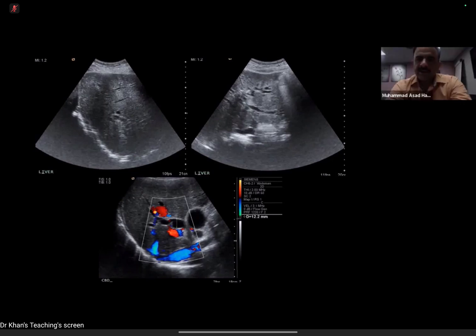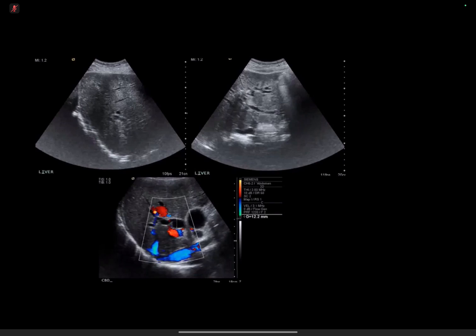Brilliant. Well done. How do you do that? So that is done under local anesthetic and ultrasound guidance to identify the peripheral ducts, and then I think you use a Chiba needle, a 22 gauge. You identify the duct, you approach the duct, and once you're in the duct, you want to check for biliary reflux to make sure you're in the right place, inject a water-soluble contrast dye, and that basically just delineates all the anatomy.